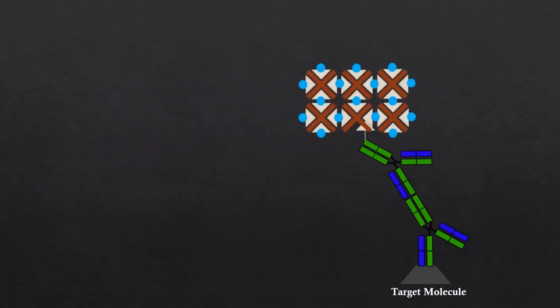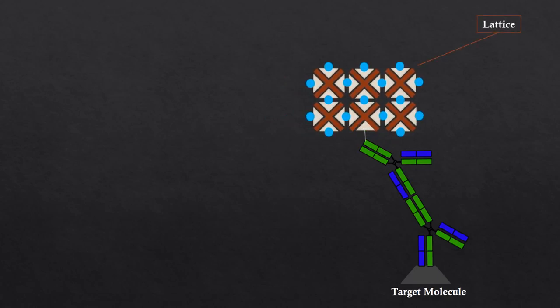The ABC method revolutionized the sensitivity of IHC methods. The basic idea was to attach a lattice of HRP molecules to stain the target molecules with increased sensitivity. The ABC method was the first method that made IHC staining a viable option for histological and pathological analysis of tissue samples. The lattice was created using the interactions between two molecules, avidin and biotin.